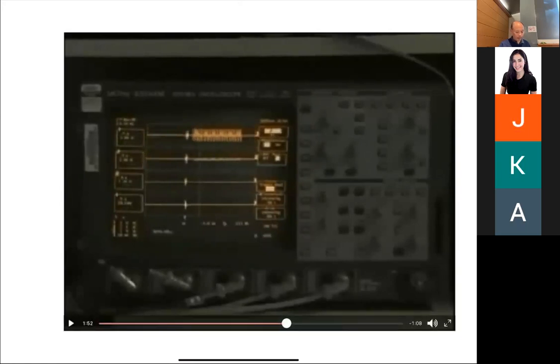Okay, so what they're doing there, and this movie is on Canvas so you can look at it, is that some have tried this, though I'm not sure how much it's used. They have the pulse sequence either do the acquisition. When you hear the sound, that's the readout gradient going back and forth, probably about 2 kilohertz or something.